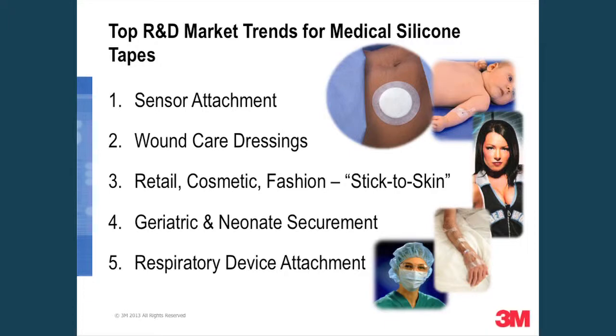Retail, fashion, and cosmetics stick to skin. We have Corey there as our model for cosmetic applications. Sticking to skin in sensitive areas can be a real pain for removal. You want it to adhere for as long as you're going to wear it, which is 8 to 12 hours, sometimes a little less. But you want it to remove without causing somebody to never want to touch it again, or to traumatize their skin just to look nice.